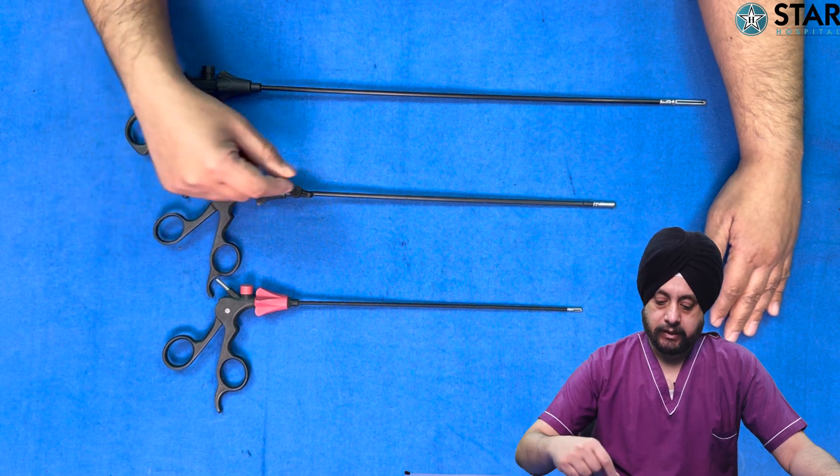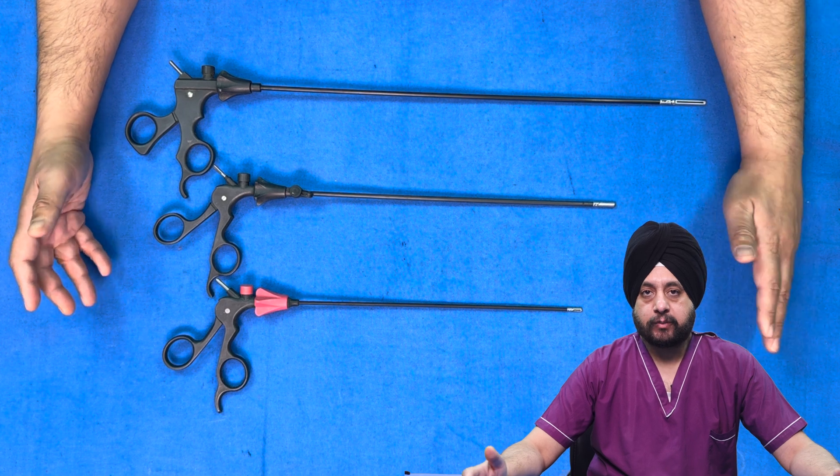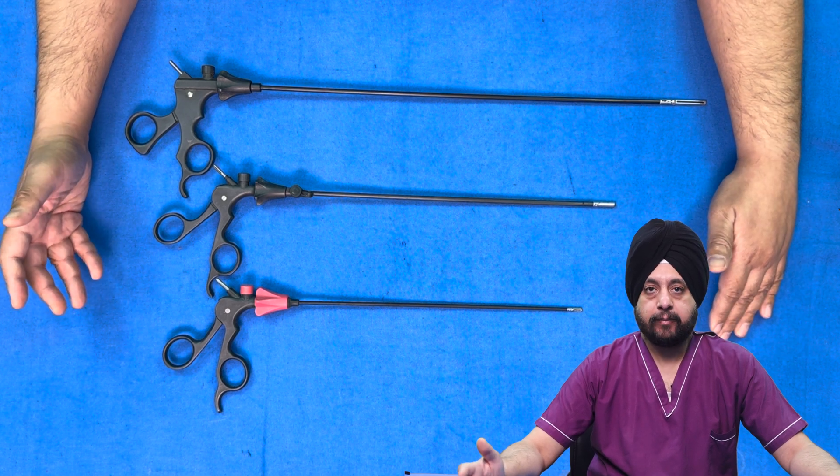Regarding width, these two are 5 millimeters and this one is around 3 mm, so mini laparoscopic or pediatric instruments are usually up to 3 mm or less.